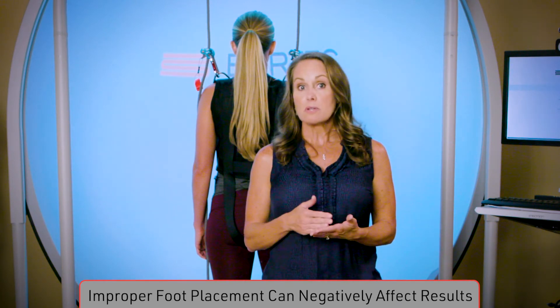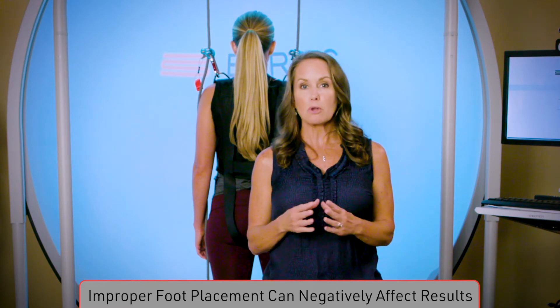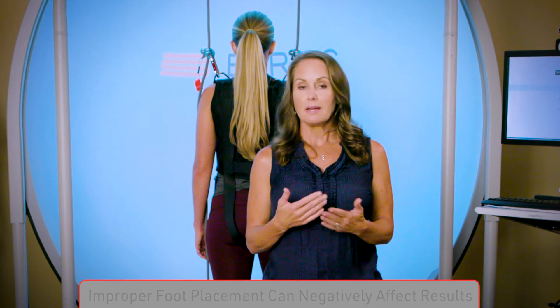Not all assessments require this strict foot placement — we'll go over this as we review each one in detail. However, it is always good to be in the habit of correct foot placement at all times to maintain consistency between assessments and reassessments.